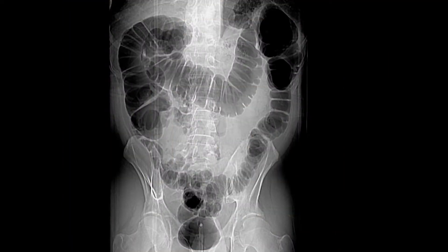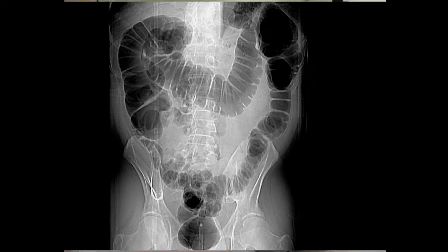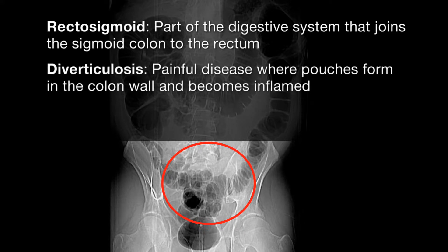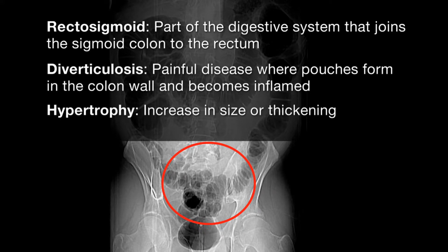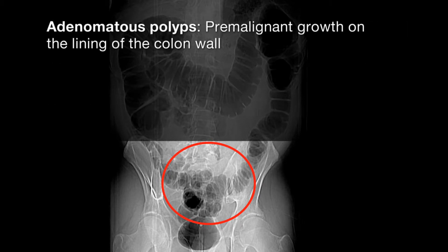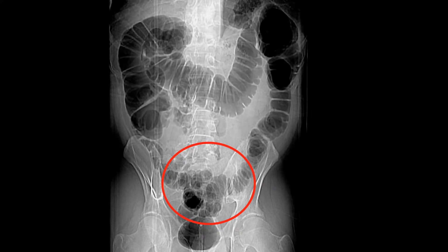What you want to see is excellent distension from the rectum all the way to the cecum, with only a little bit of reflux into the small bowel. We like for the techs to check this before they go ahead with scanning. The rectosigmoid is the area that will give you the most problems because of diverticulosis and muscular hypertrophy, and at the same time it has the highest incidence of adenomatous polyps and cancers. So you really have to focus on the rectosigmoid to assure that you have appropriate distension.